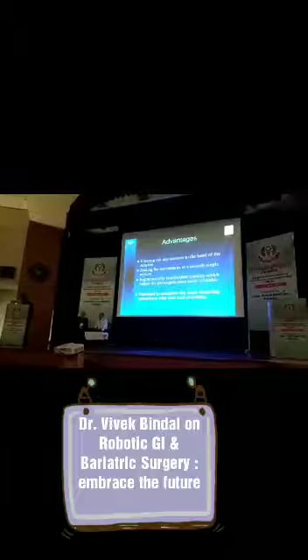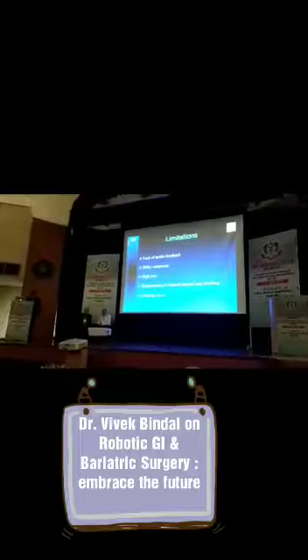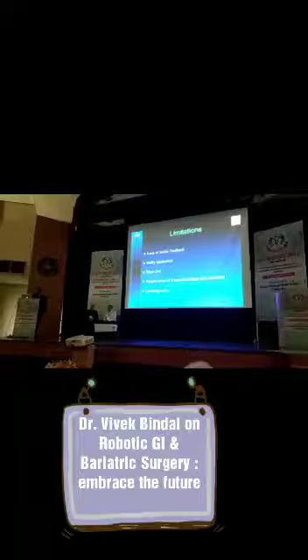Right now there is no tactile feedback. It's bulky and costly equipment, and there is obviously a learning curve. But with time, more and more companies are coming into it, and the technology is getting better.